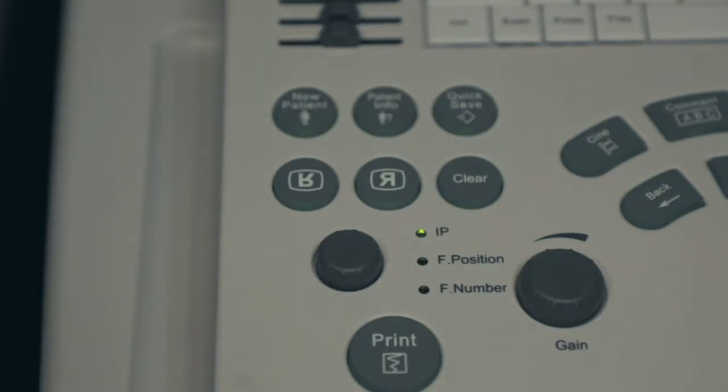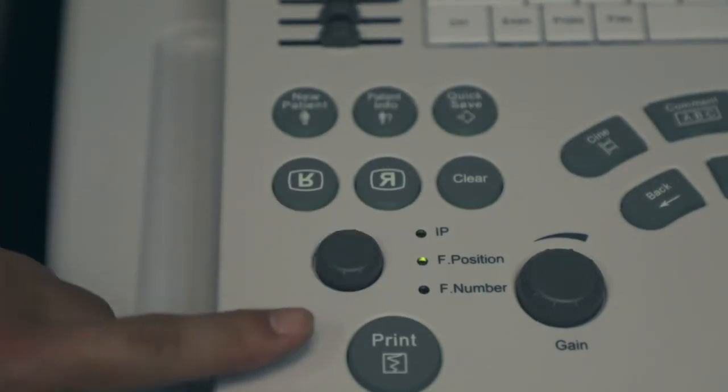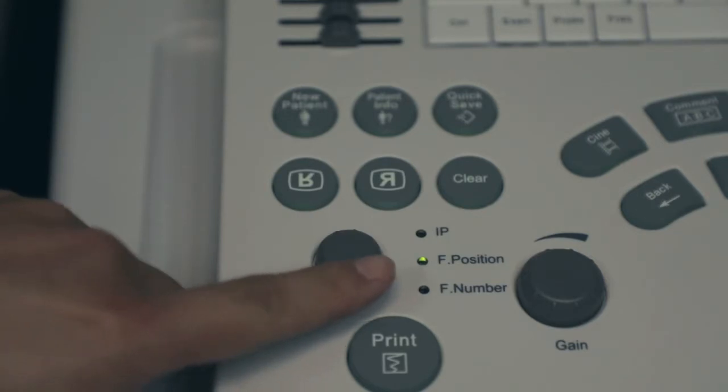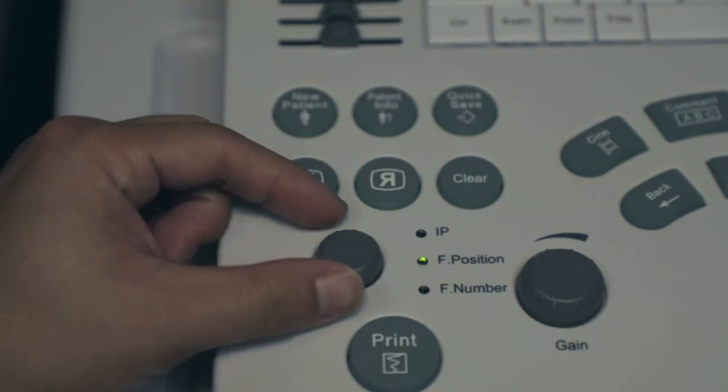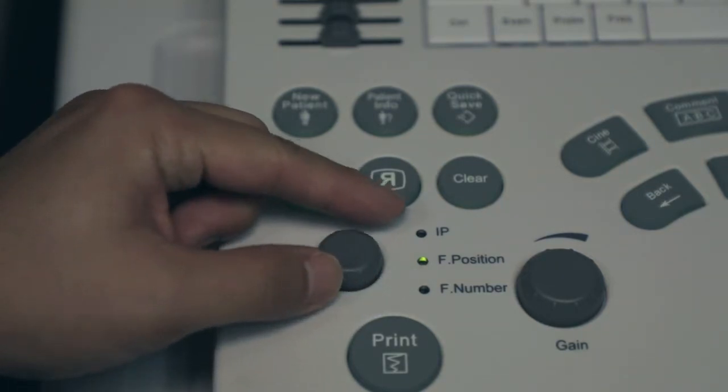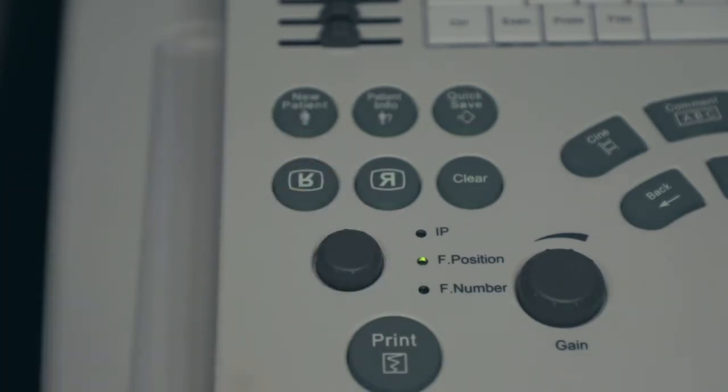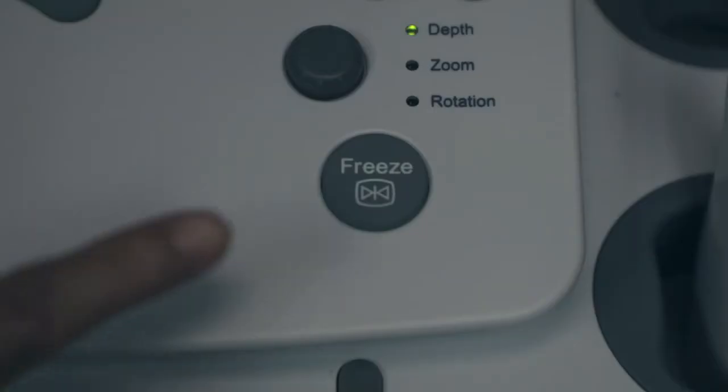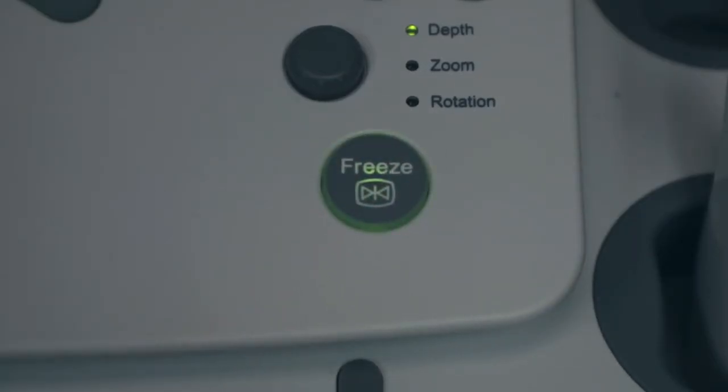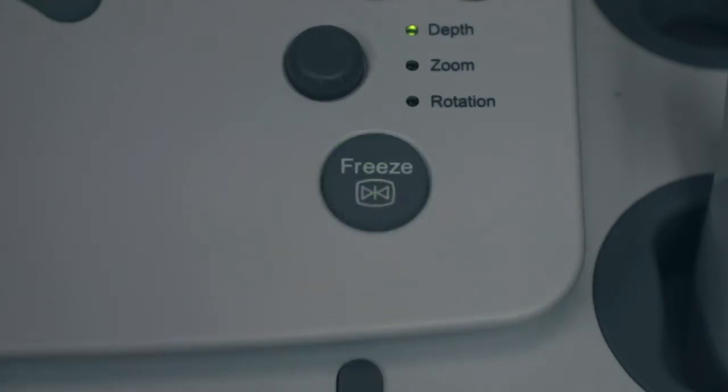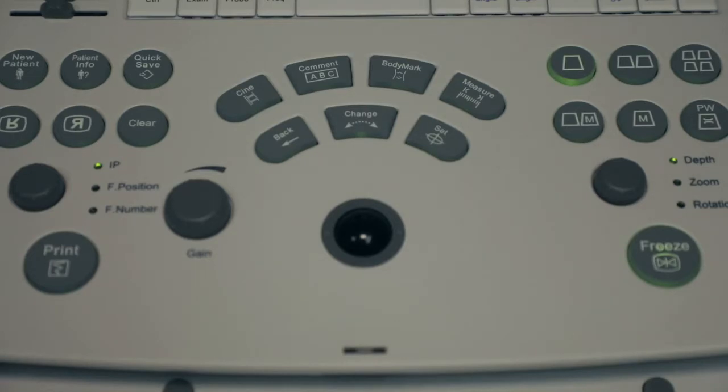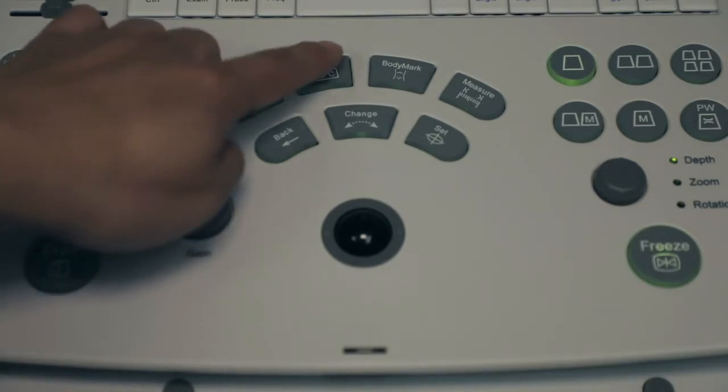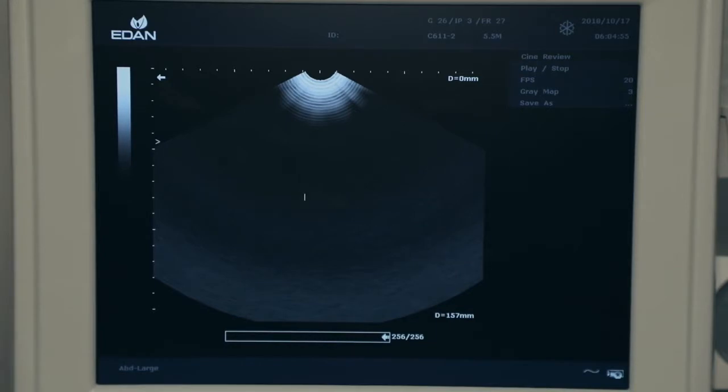Press knob down to highlight focal position. Turn knob to place focal point at desired area. To freeze an image, press the freeze key. To label an image, press the comment key, move the cursor to desired area with trackball, type and press set to confirm.